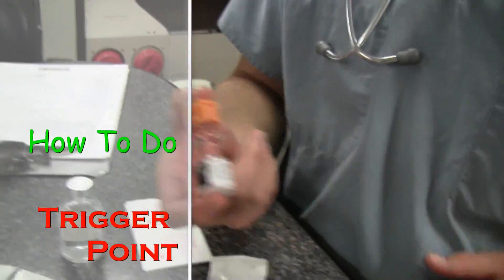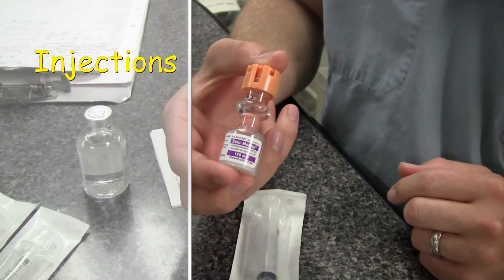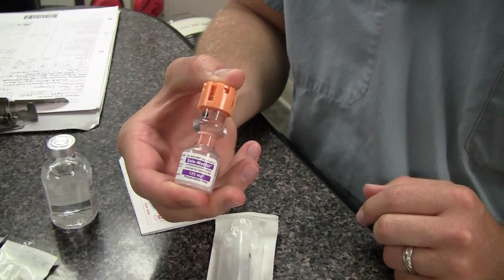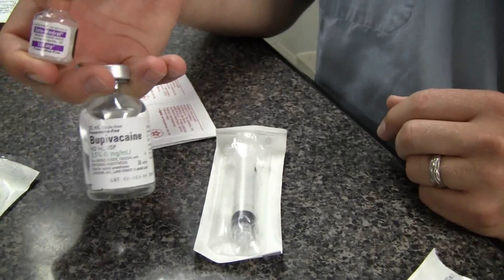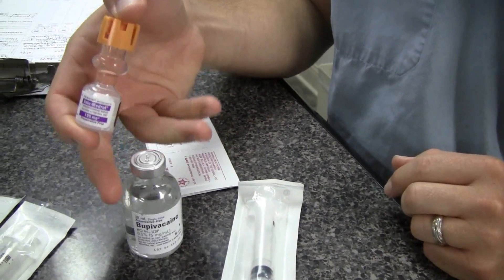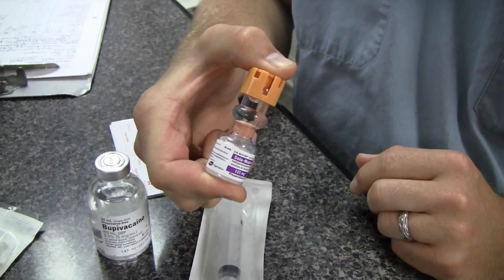We're going to do a trigger point injection today using some Solu-Medrol — about 40 milligrams from a 125 milligram bottle. We'll use about 0.6cc of that, then we're going to do a 5cc syringe and mix it all together with bupivacaine and the Solu-Medrol, and we're going to inject some trigger points.